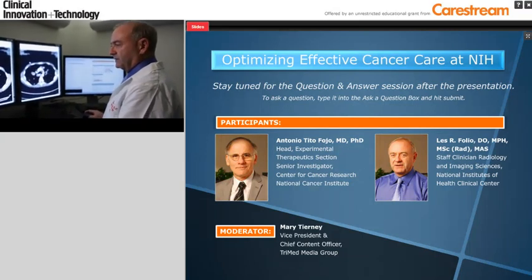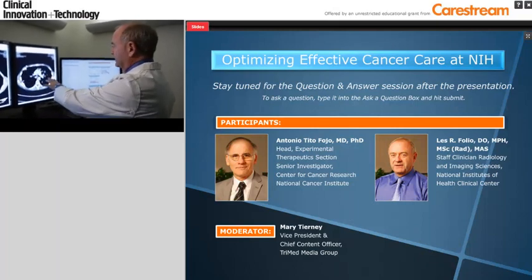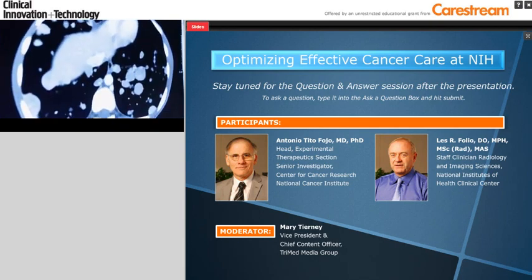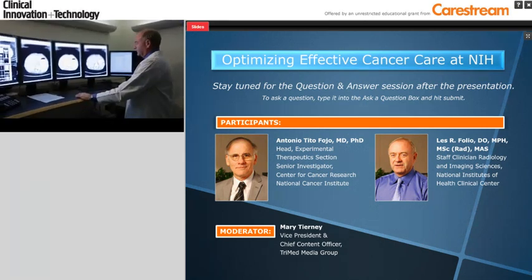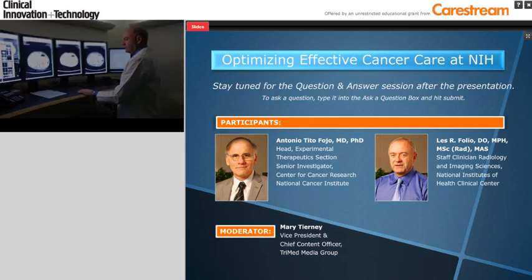There's metastatic deposits all over the lung. Anything that is not dark here is a metastatic lesion from this very aggressive sarcoma. And the ability to follow these up, you can see if you're measuring many lesions, again, that can be monumental without tools that automate the process to allow for segmentation.